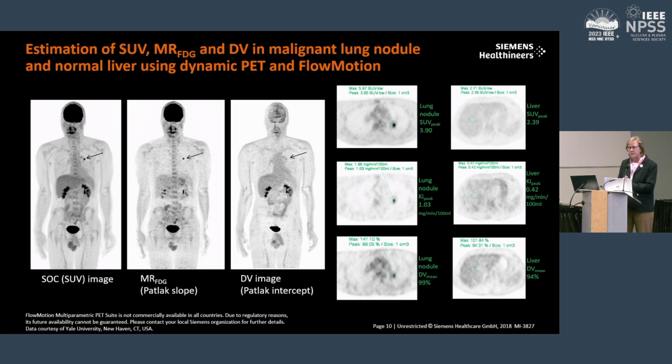And so you can see there's uptake in the spinal column. The image on the right is the free FDG. So you see kind of the blood areas. The vessels are clearly apparent, and the liver obviously has a lot of blood background. And in your mind, if you can sum those 2 images on the right, you pretty much get the image on the left. So it's like we've broken the SUV image into its components of the trapped and the free FDG.